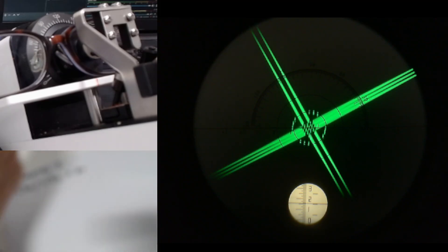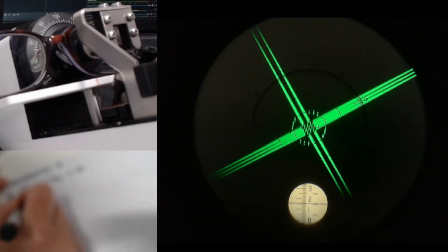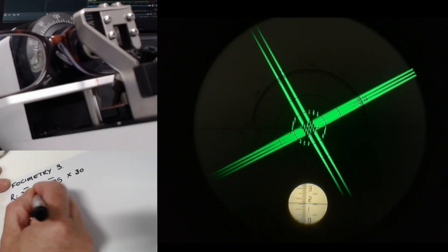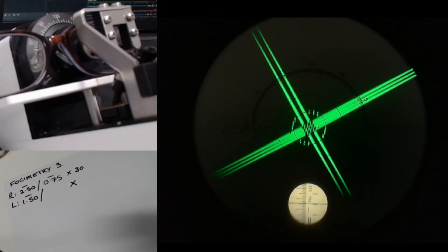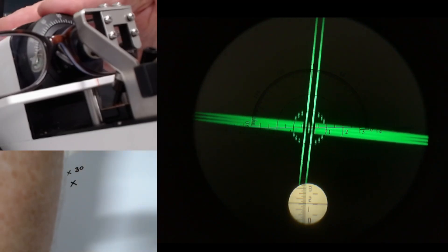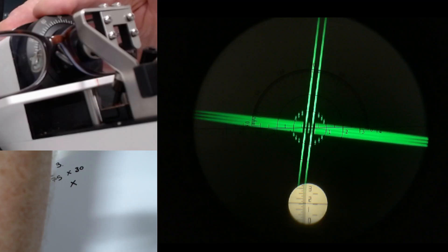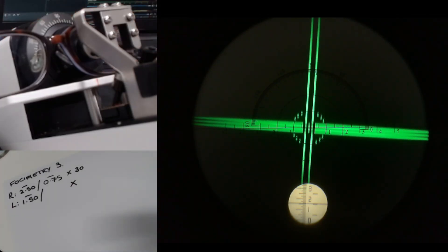So that is reading for the left eye — minus 1.50. I'm going to leave space for the cylinder and I'm going to work out the axis. I'm going to turn the dial, lining up the two green lines with the little dashes in the middle. That is about there — that looks good.